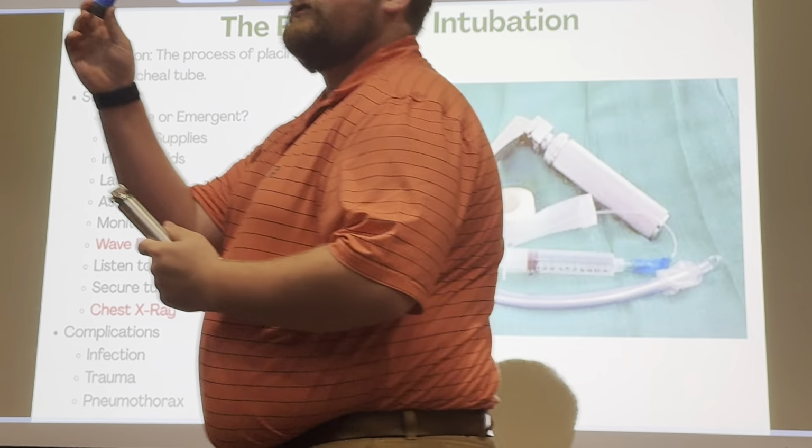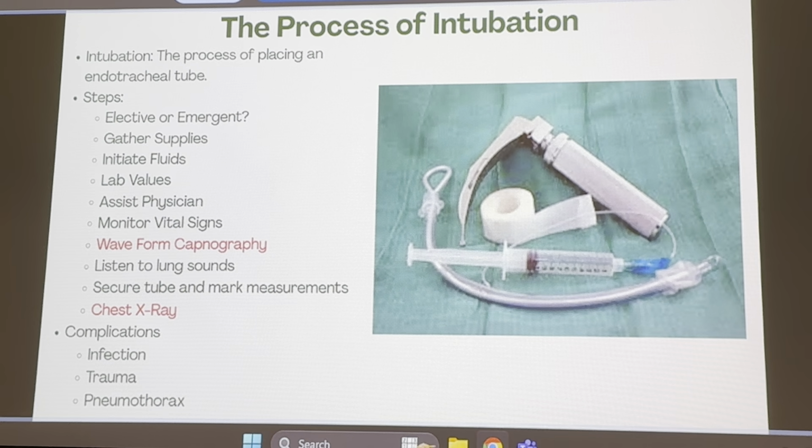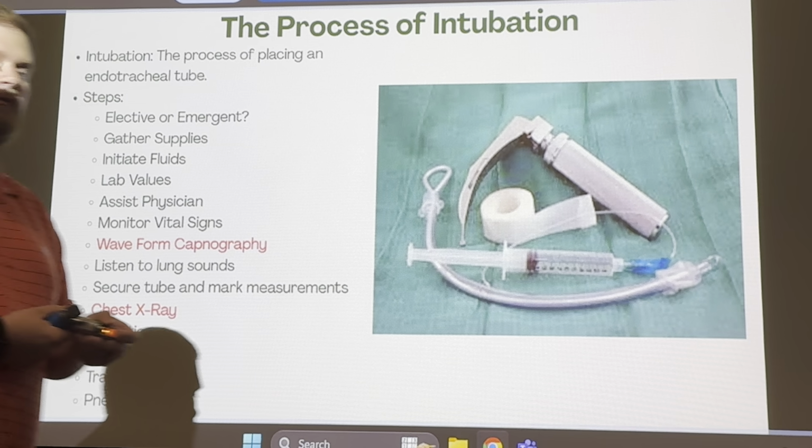Most hospitals are going to more of these disposable kinds, so you can just chunk them after use. And then you'll still see some of these older, old-fashioned ones. These are not disposable. They wipe these down and reuse them, but there's a little light at the end of it. So it gives a little bit of light to that airway.